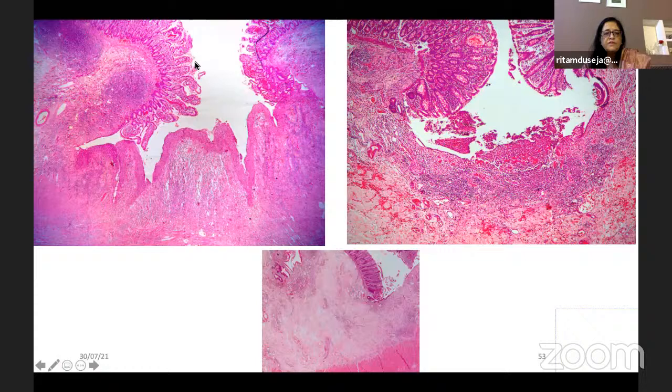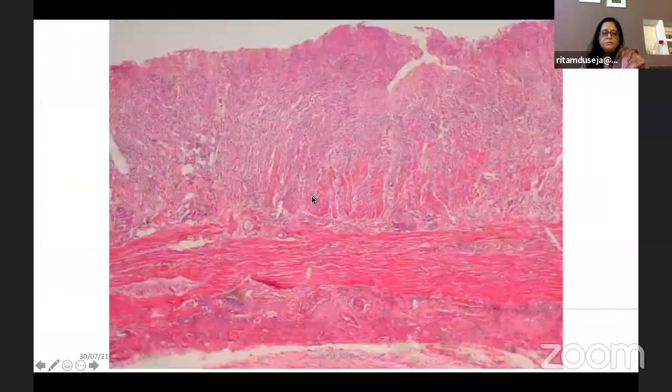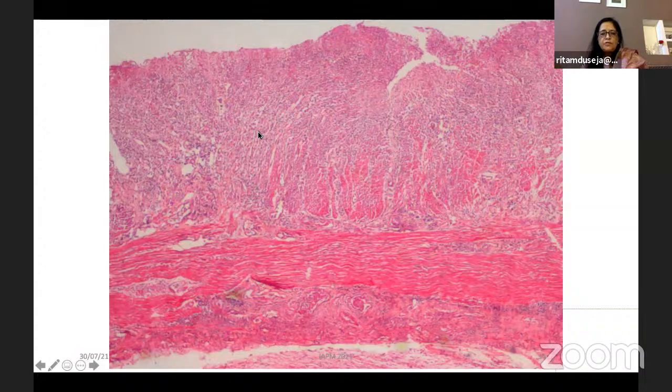Here we are seeing sections of GI where there's an ulcer. There's no lymphoid base under it to say it's a typhoid ulcer. There are no granulomas, so that means it's not tuberculosis or a granulomatous pathology. And you see there is submucosal fibrosis. At places at the edges, you see some evidence of healing and submucosal fibrosis. So the presence of submucosal fibrosis, healing ulcer, reepithelialization, and no granulomas would indicate to me that maybe it's a case of chronic ischemia with a superadded acute element.